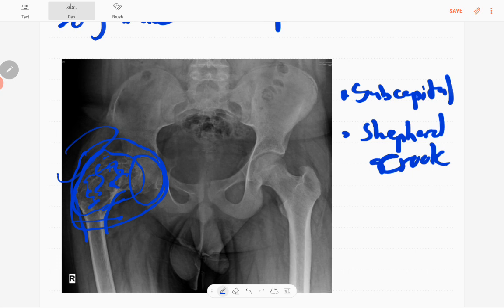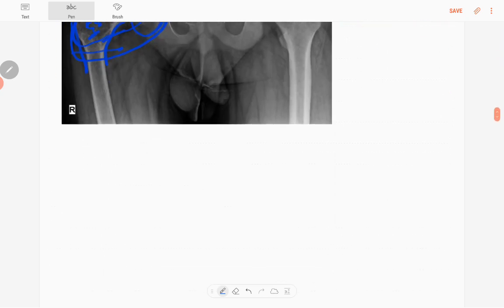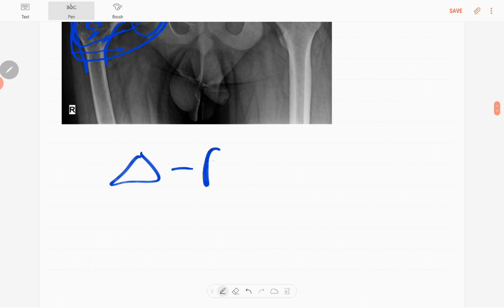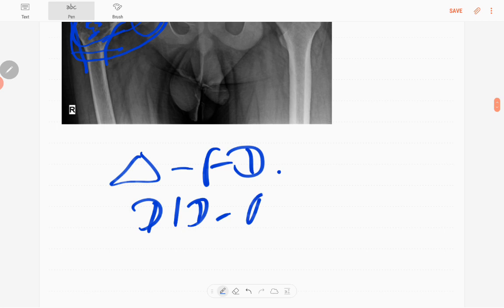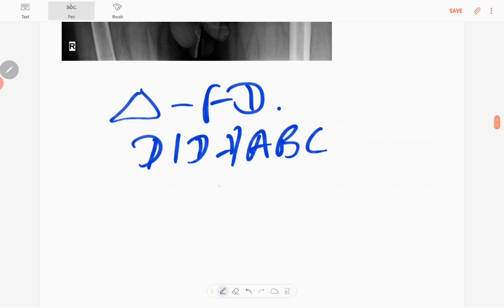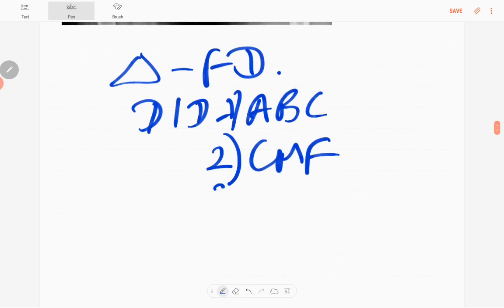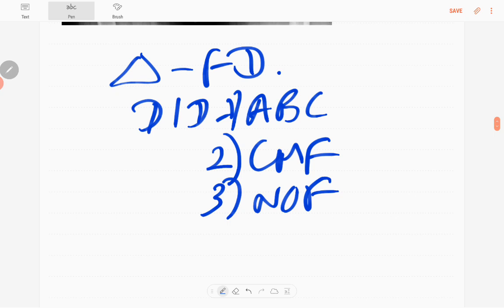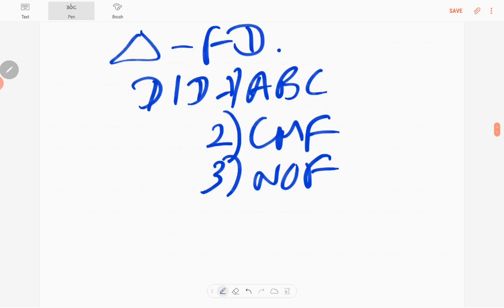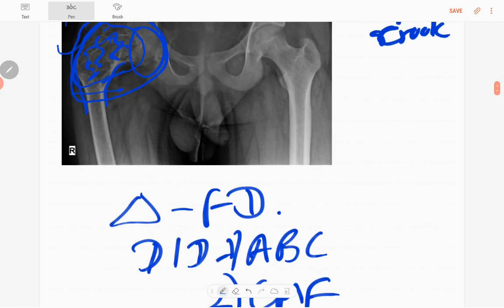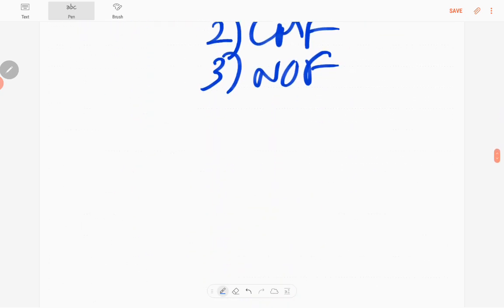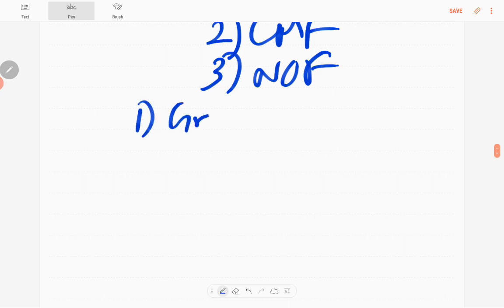So the diagnosis is fibrous dysplasia. The differential diagnosis of this lesion includes aneurysmal bone cyst, chondromyxoid fibroma, and non-ossifying fibroma.